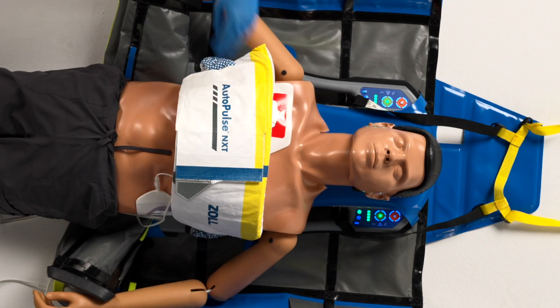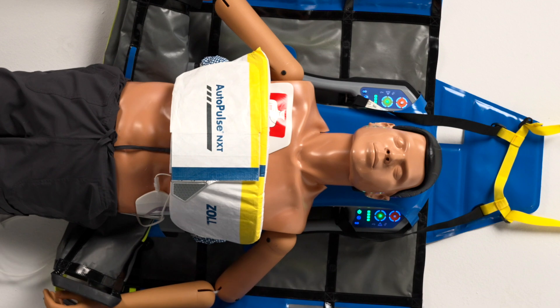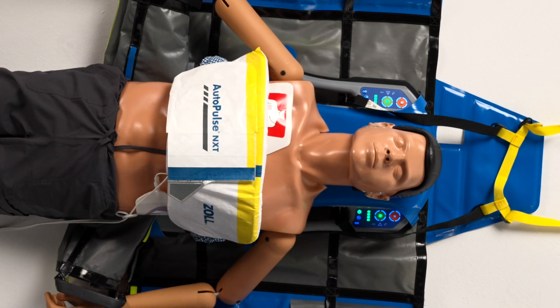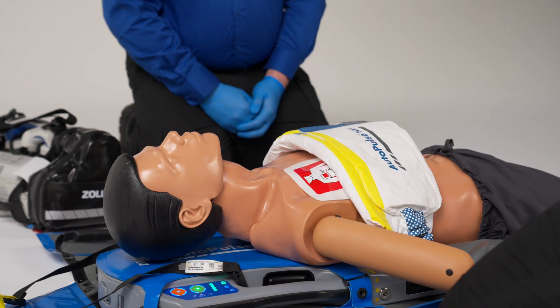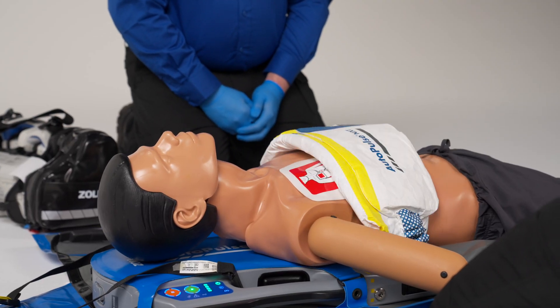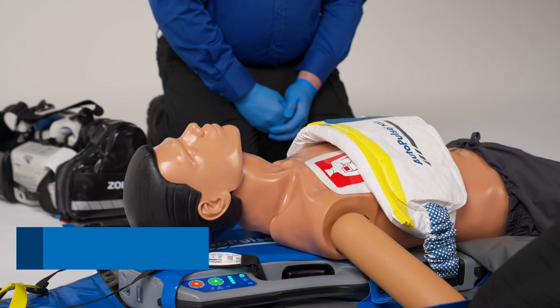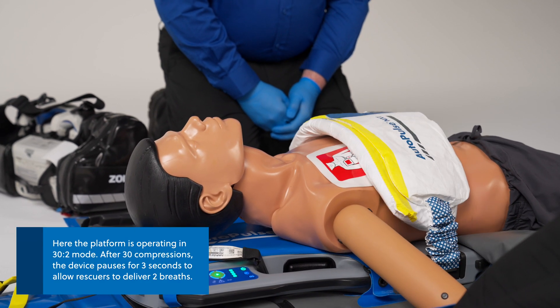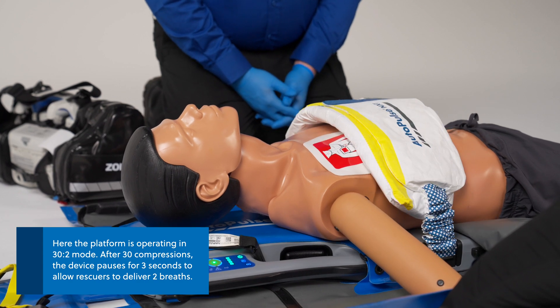Make sure to align the yellow line on the AutoPulse NXT band with the patient's armpits. Press the green triangle start button to begin compressions. Keep hands clear of the AutoPulse NXT band while it is analyzing and sizing to the patient. The AutoPulse NXT band will automatically size to the patient's chest and begin compressions at a ratio of 30 to 2.